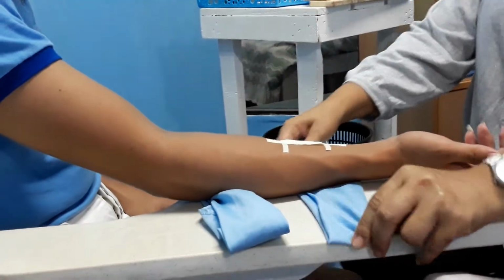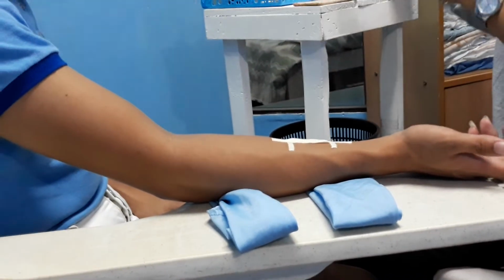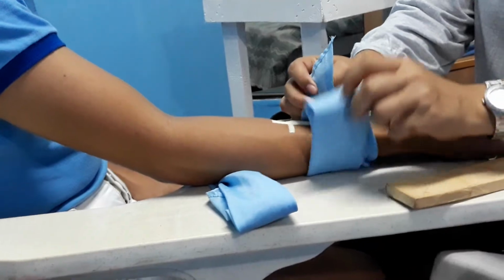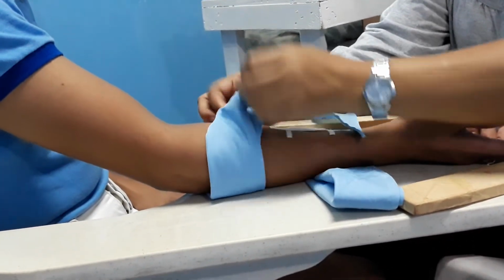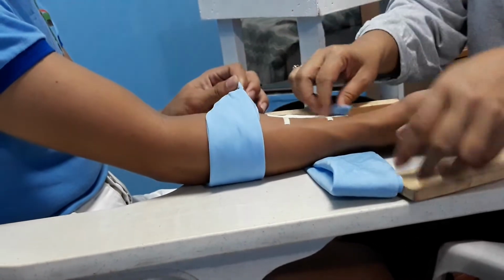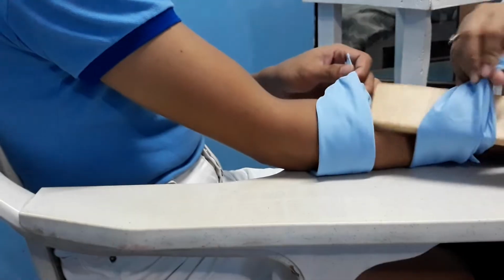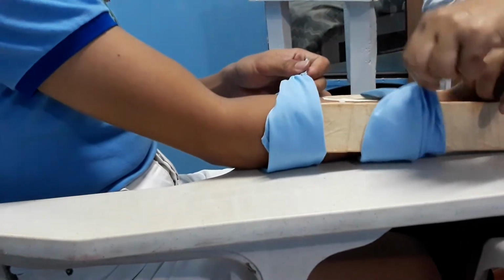Okay, then after that you may now apply your splint. Your splint should not be placed inside the tray. Why? Because the tray is said to be contaminated. If you're going to apply the splint there, there's a tendency that you are contaminating the tray. You may ask your patient to hold the tip of the bandage like that, and then that's the time for you to insert the second bandage, your second splint.